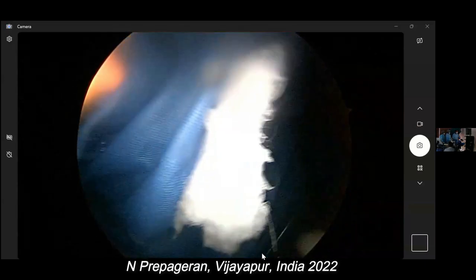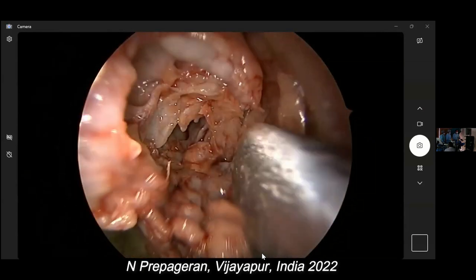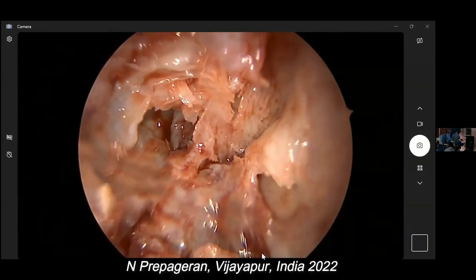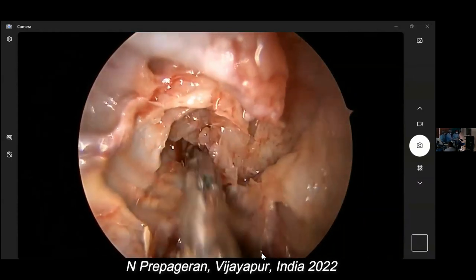is the anterior wall of the sphenoid sinus. So all we need to do is go to gate number three. Let me remove the mucosa a bit so that you have a better view. So now I'm going to remove the mucosa of gate number four.